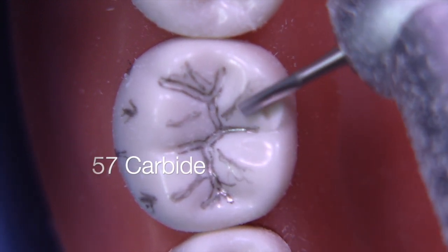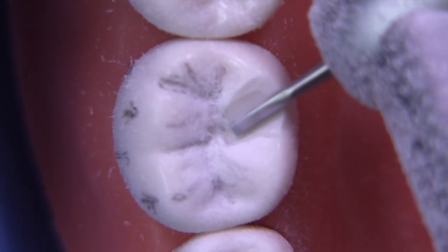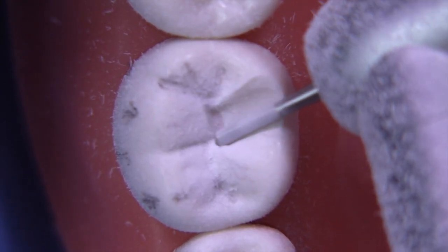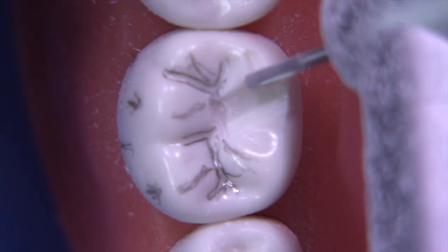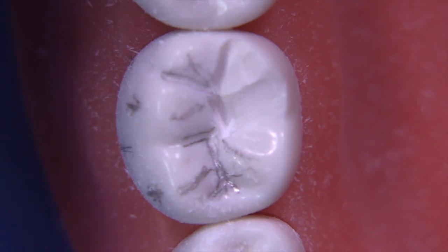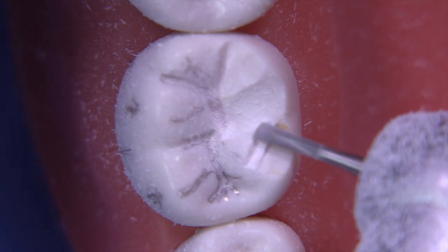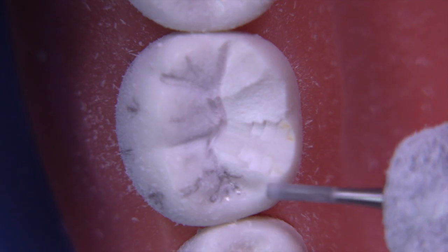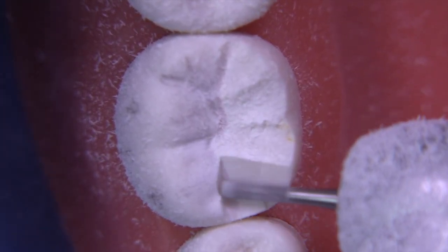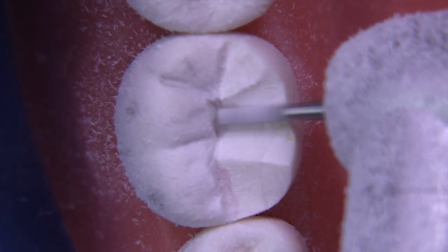I like to start with a 57 carbide burr — it's one millimeter in diameter — and I like to utilize the plane reduction technique. This is the C plane, all across the lingual from the mesial to the distal, reducing these little segments one millimeter or a little bit more in depth initially. I consider each one as a separate little project. By focusing on one area at a time, you end up with a little bit more control of the reduction and can follow the inclination of the cusps a little bit better.